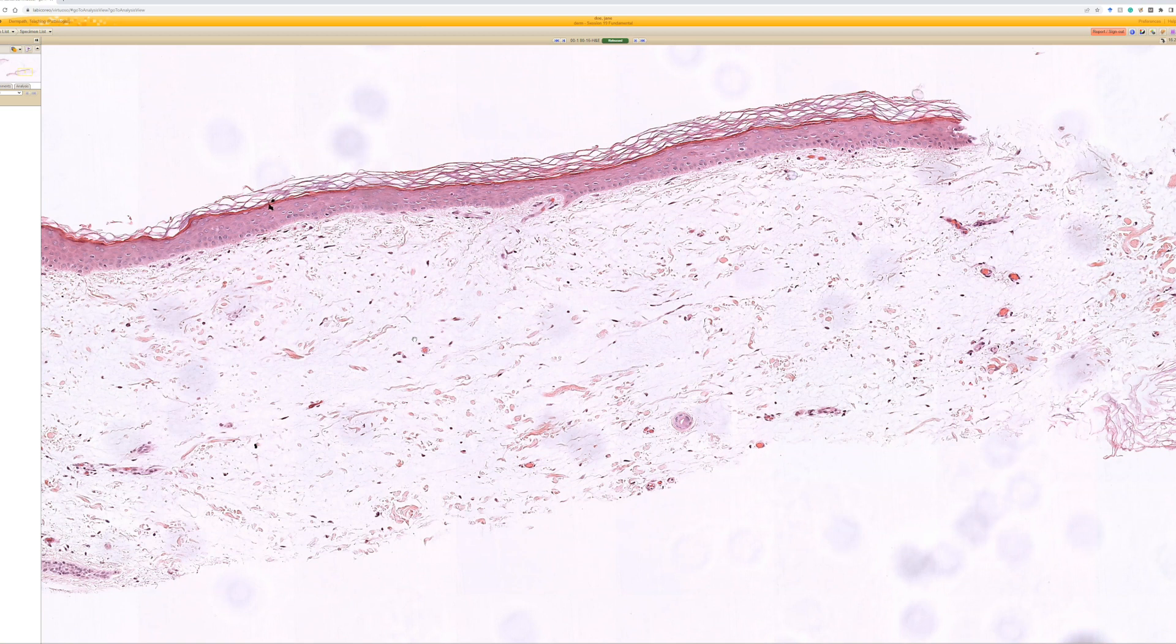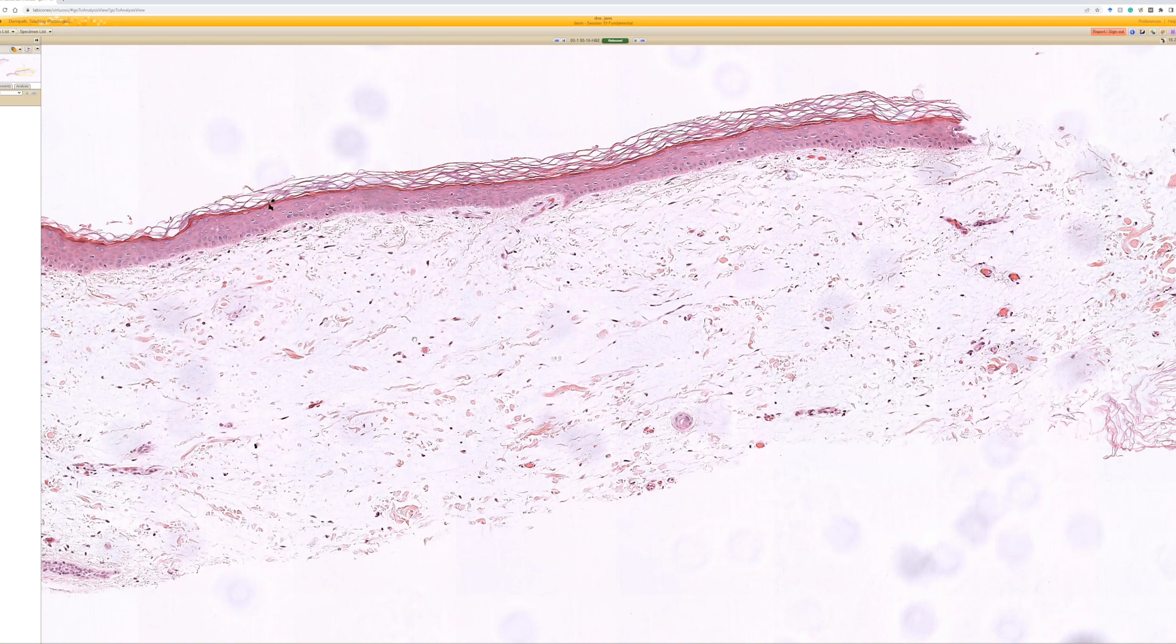The one thing that sometimes can also get confused with is a cutaneous myxoma, also known as superficial angiomyxoma. I have other videos about that. The difference there is those are usually bigger. They usually go deeper into the dermis and even into the subcutis.